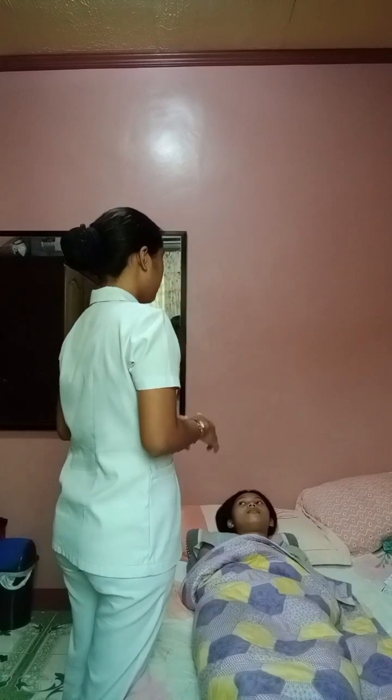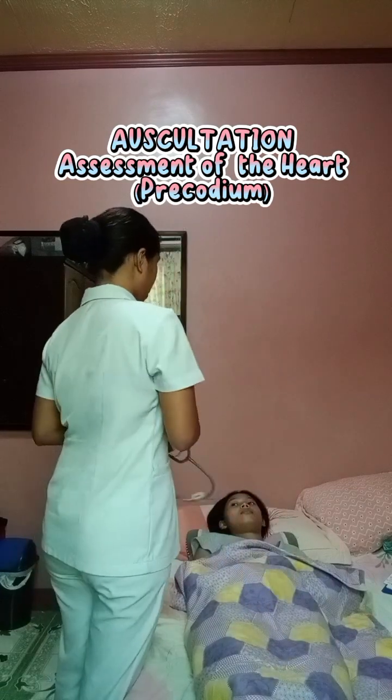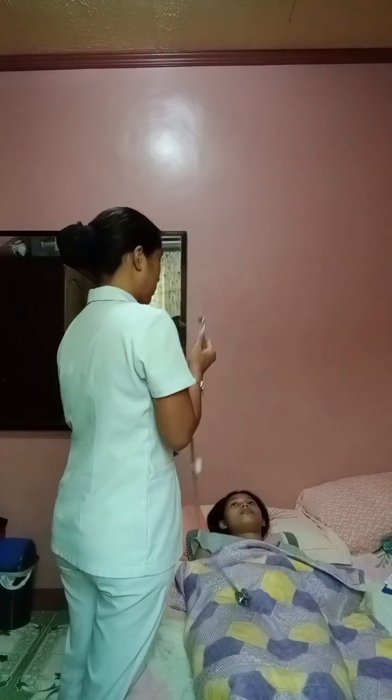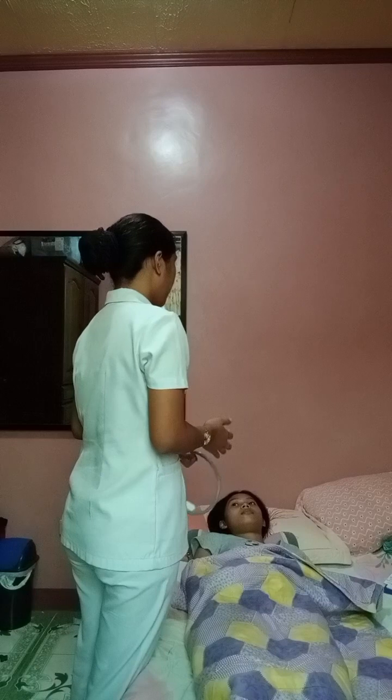Alright, so this time I'll be assessing your heart rate. Using the diaphragm of my stethoscope, I'll be placing it on the apex. Right, so I'll be assessing for the rhythm also. Alright, so heart rhythm is completely normal or regular.